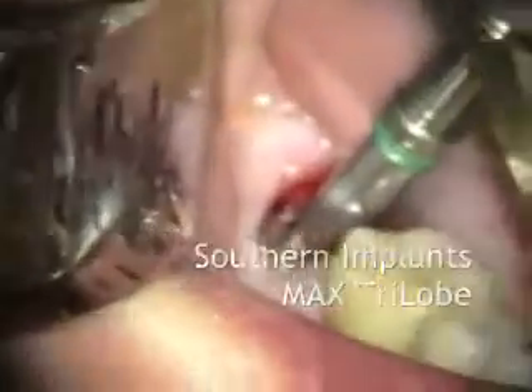We're putting in an eight millimeter wide, nine millimeter long max implant.